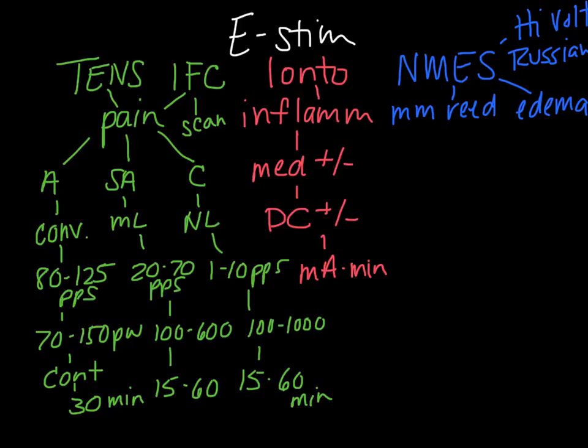Again, on some of the newer machines, there may be different modes and settings where the duration may be much longer to produce that same dosage. So you do need to check with the manufacturer. But know that your time on the machine is a function of the dosage you want of that medication.